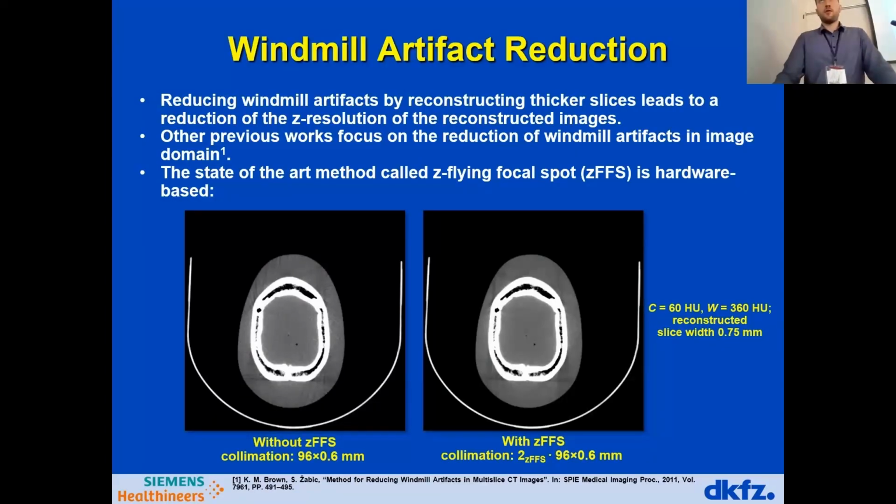We thought about that. For the current state, we don't know how to implement this. We thought about also a denoising step by training with the clinical data set, which could be a possible solution. We were also thinking about how to pre-train or just train on clinical data, and there's also the possibility to retrain only certain parts of the network. Not yet, but it's a nice idea, of course, for discussion.